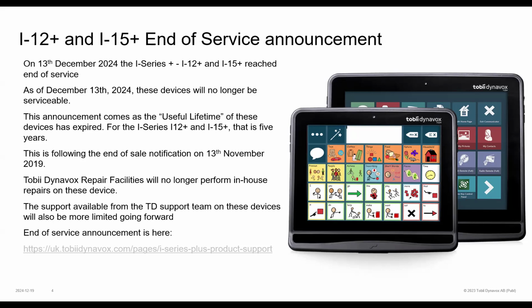The announcement comes as the useful lifetime of these devices has expired. For the I series, i12 Plus and i15 Plus, that was 5 years. They reached end of sale on 13th of November 2019, and as part of that, we sent out an end of sale notification that detailed that the end of service on these devices would be on the 13th of December.